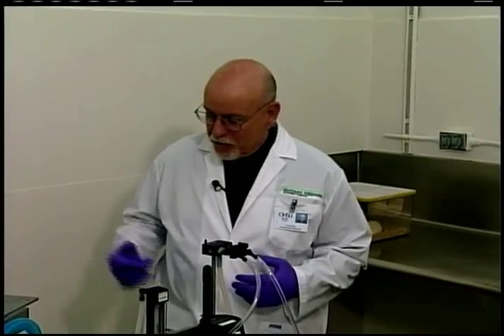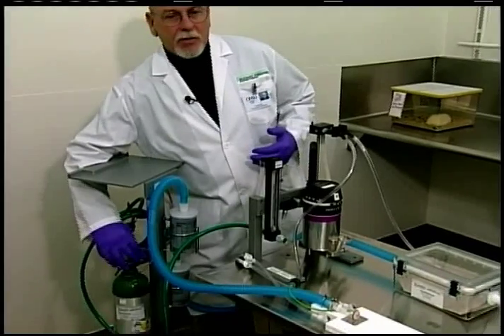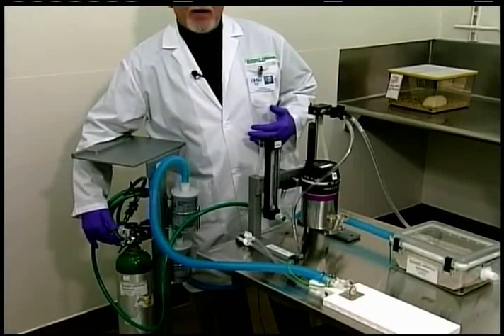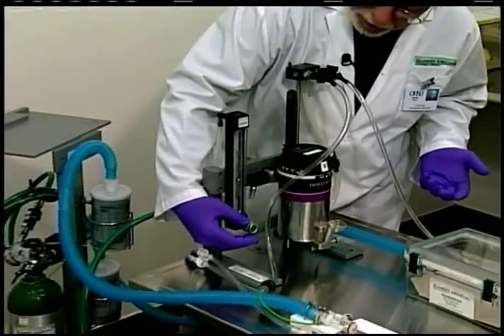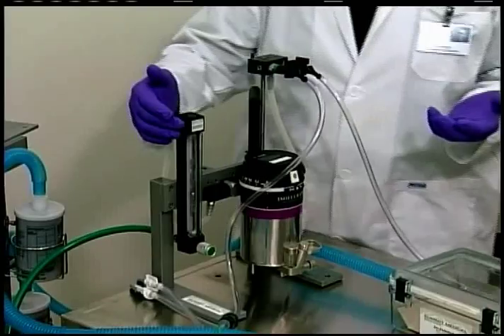Before we get going and handling the subject, however, I'd like to give you a heads up as to some of the procedural things that need to be done before you even put the animal in the induction chamber. First, make sure that we have a supply of the carrier gas, the oxygen. Make sure that the oxygen tank is on. Look at the gauge on the tank and ensure that you have enough oxygen to do the procedure that you want to do. Turn on the oxygen flow meter to 1 liter per minute flow, and ensure that the flow of oxygen is coming out of the flow meter.